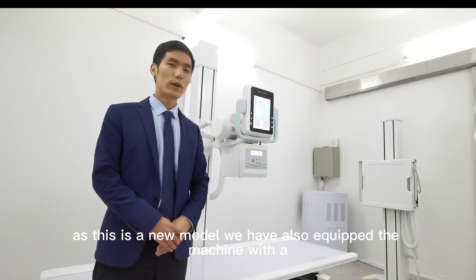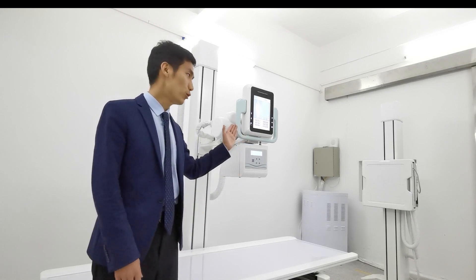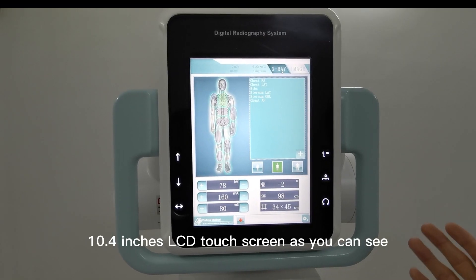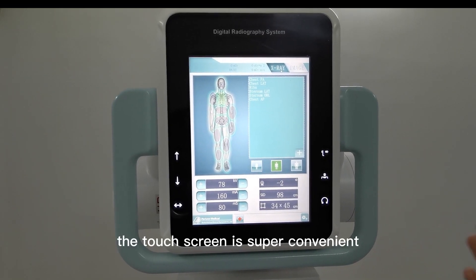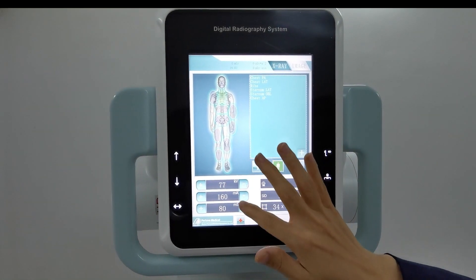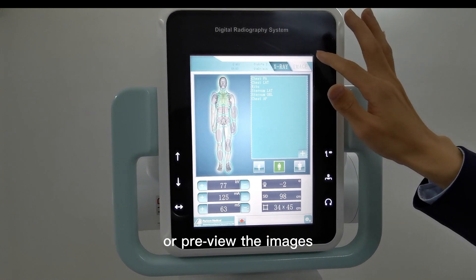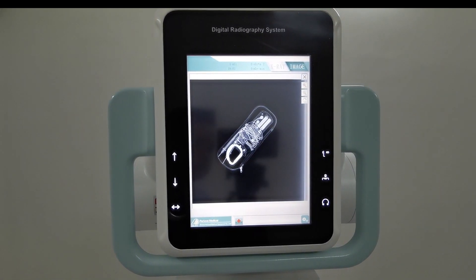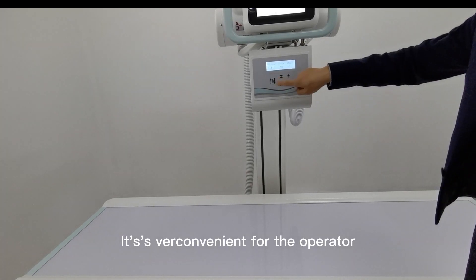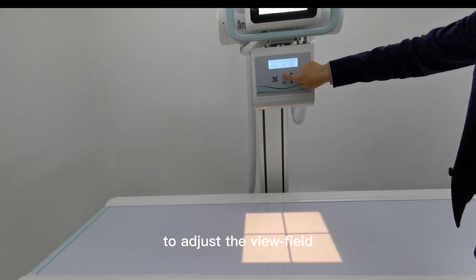As this is the new model, we have also equipped the machine with a 10.4-inch LCD touchscreen. As you can see, the touchscreen is super convenient for the operator to set all the parameters or preview the images. Down here is our electric elevator, which is very convenient for the operator to adjust the view field.